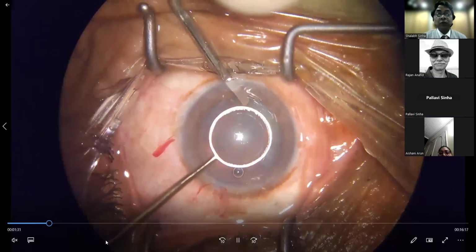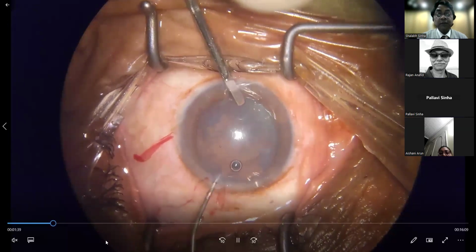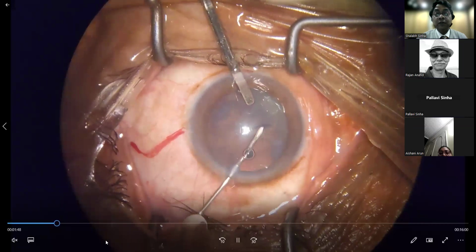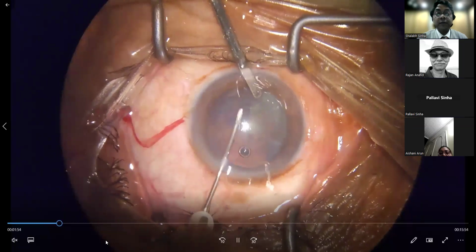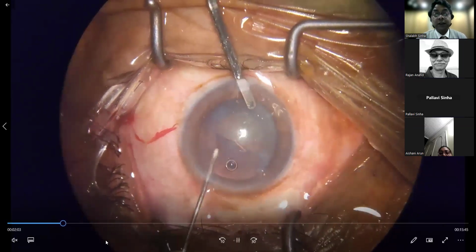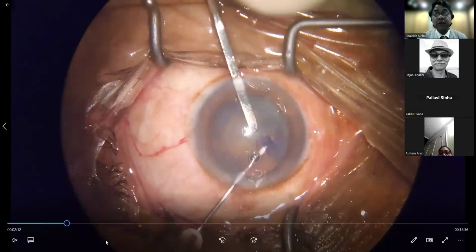This is Gaurav Luthra's rhexis marker to give some measurement of the rhexis that is planned. So usually I rely on the rhexis marker and then raise a flap of the anterior capsule, flip it onto its surface, and slowly the repetitive movements are made so that we get a circular rhexis.